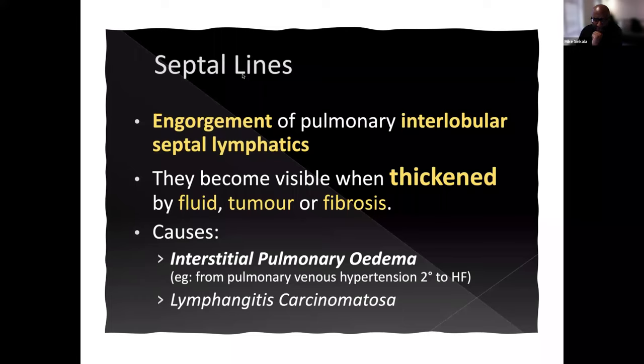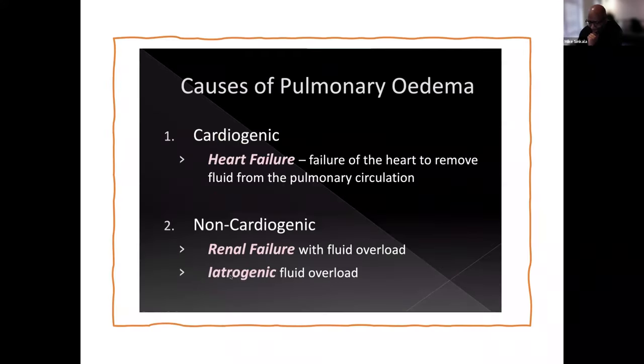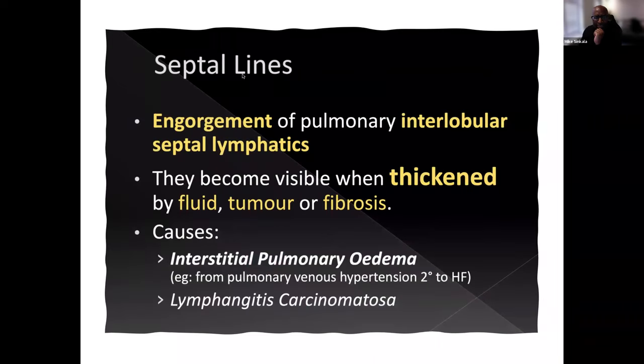Let me say this. When you're looking at a chest x-ray, there are conditions that are either parenchymal or infections, or we can say interstitial diseases as well. Interstitial diseases and lung parenchymal diseases are totally different. So septal lines in this case are lines that you see in the subpleural space because of the accumulation of fluid in them.